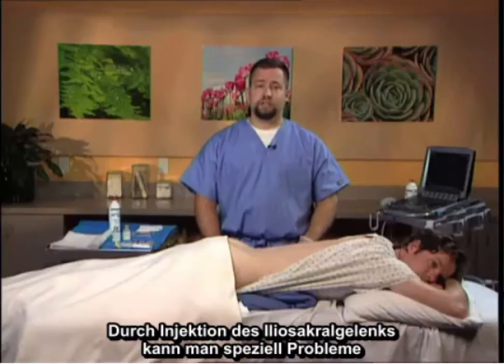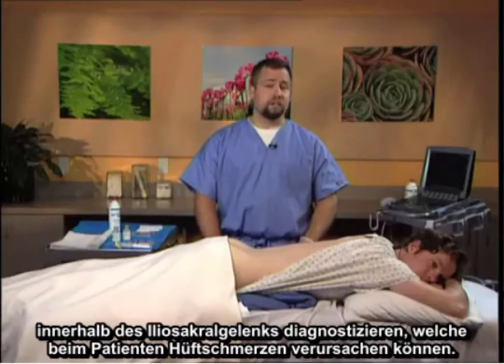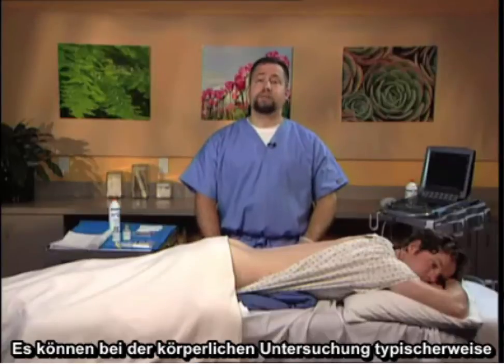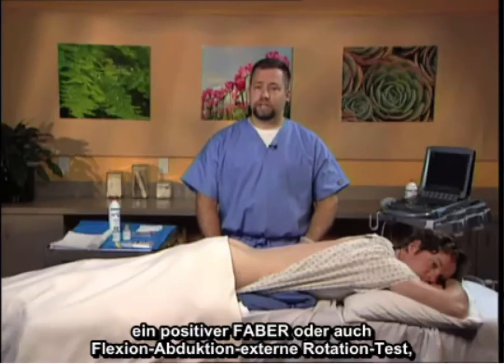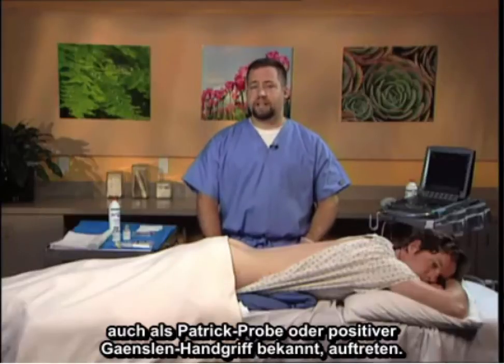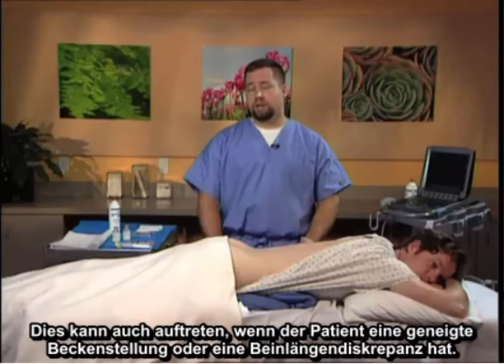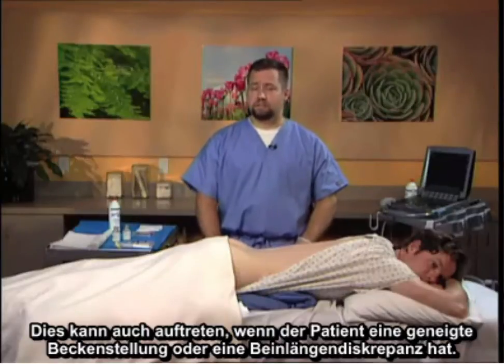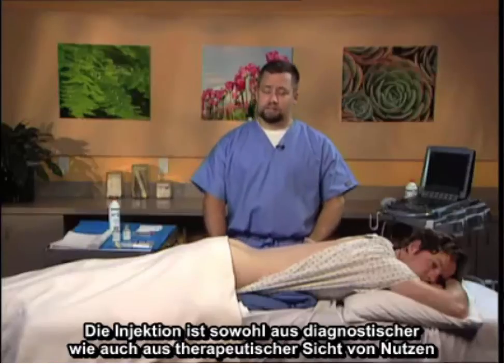The sacroiliac joint injection is useful specifically to diagnose issues within the sacroiliac joint that might be causing hip pain to the patient. Typically on physical examination there might be a positive FABER, or flexion abduction external rotation test, also known as Patrick's sign, or a positive Gaenslen's maneuver. This can also occur when a patient has a pelvic tilt or a leg length discrepancy. The injection is useful both diagnostically and therapeutically.